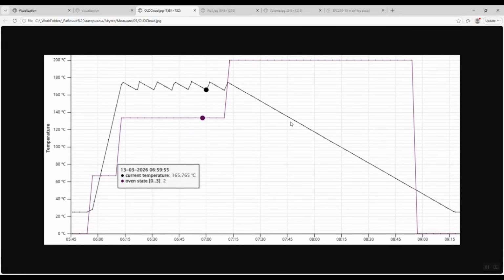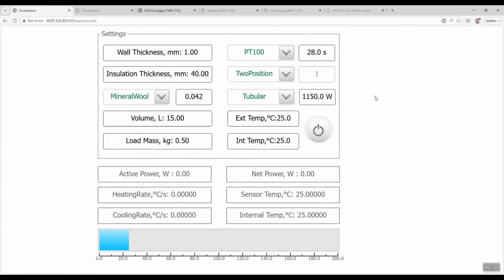Let's fix this behavior in the emulator project and create a realistic physical model of the thermal balance, or simply put, a realistic physical model of the temperature change process inside the sterilizer chamber. For this purpose, I have improved our emulator a bit. Let's switch to the web visualization of the updated CODESYS project and take a closer look at its new features.